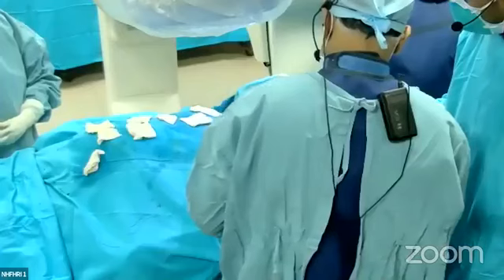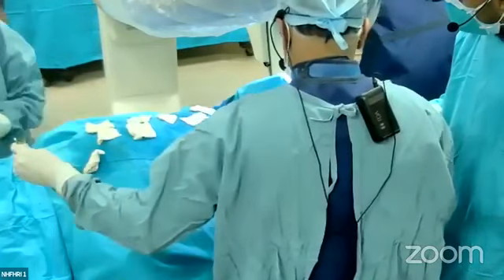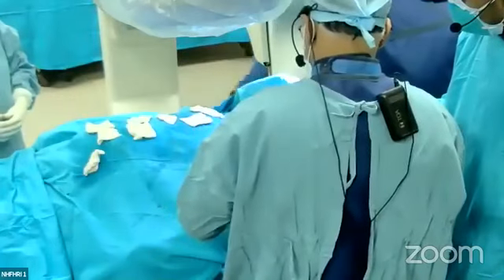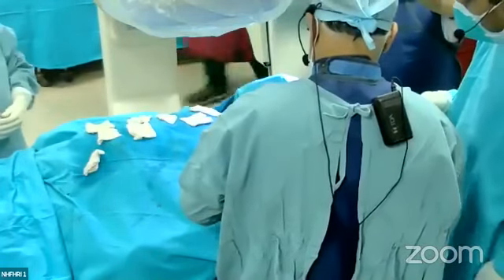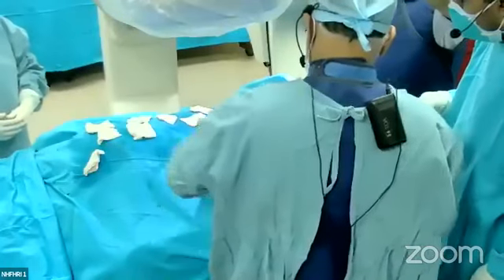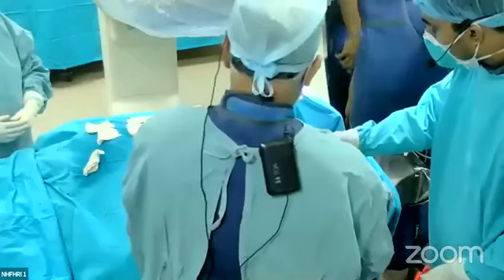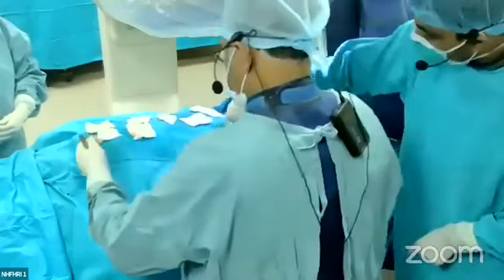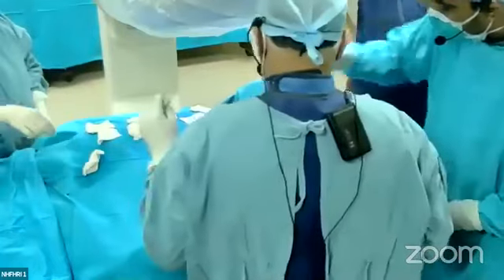Sometimes an X-ray that contains the dual chamber pacemaker is given and all the questions come from here. What are the indications of this dual chamber pacemaker? What are the pacing nomenclature? What is DDDR? What is DDD? What is VDD? Like this, all the nomenclature.